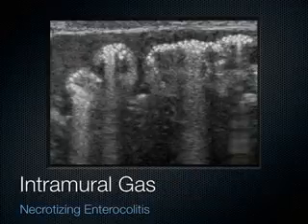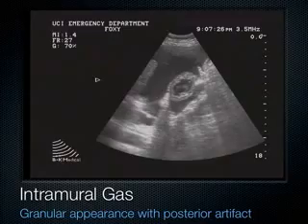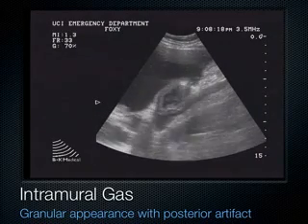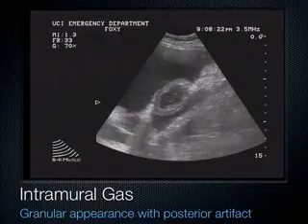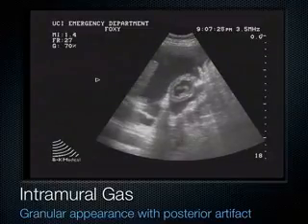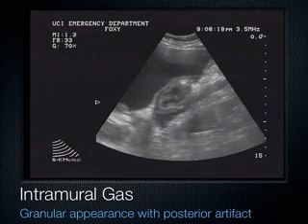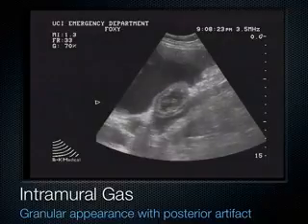Okay, over here, this is a patient who's got a very severe condition called necrotizing enterocolitis. We see air in the wall, intramural air. This is another patient that we had in the emergency department. This is all ascites right here. So ascites builds up when the liver starts to fail. Fluid builds up, and we can actually see the intestine very well when ascites outlines the loops of bowel. And here we see intramural gas building up inside this person's bowel wall.